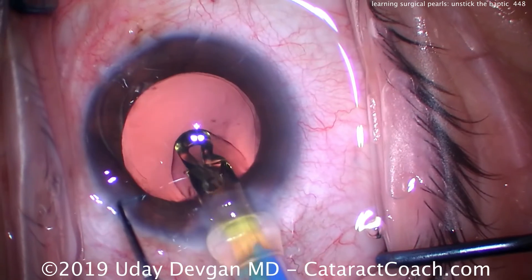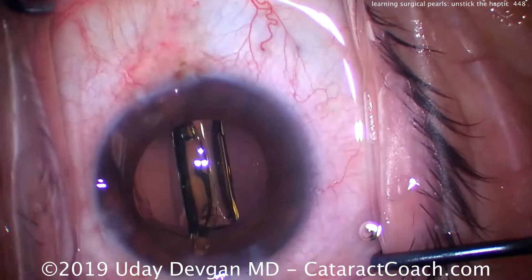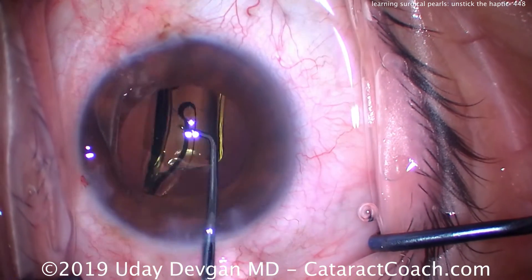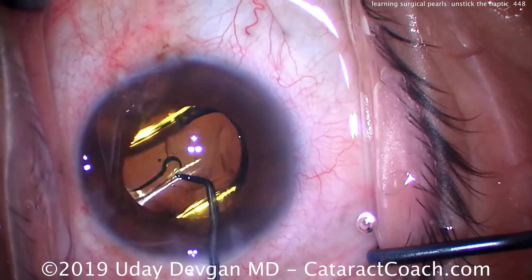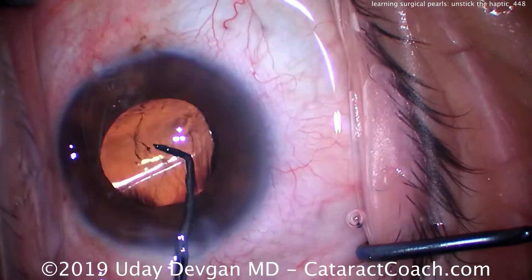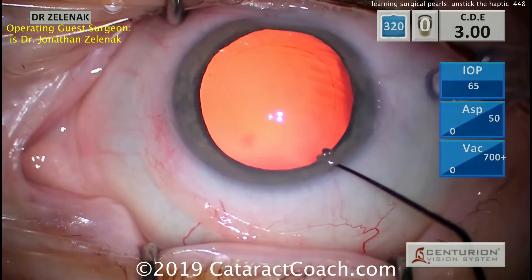Now you'll notice these cases are getting progressively harder. Here's one where the haptic is going to really stick to the optic and we need to release it. There are a few ways of doing it. The technique I'm showing here — I'm just pushing the haptic along the surface of the optic. We can also try to lift it; we can do other techniques.